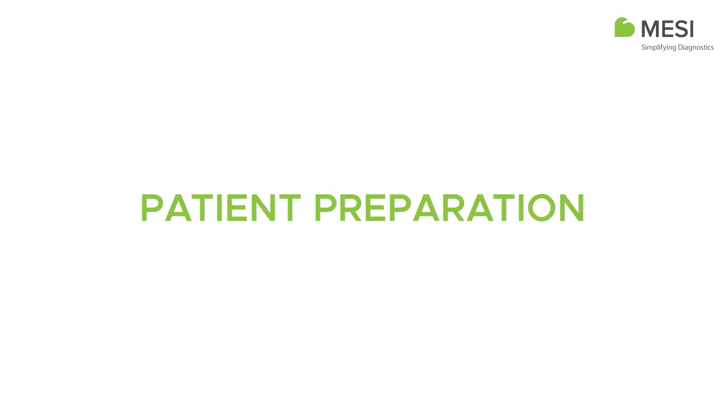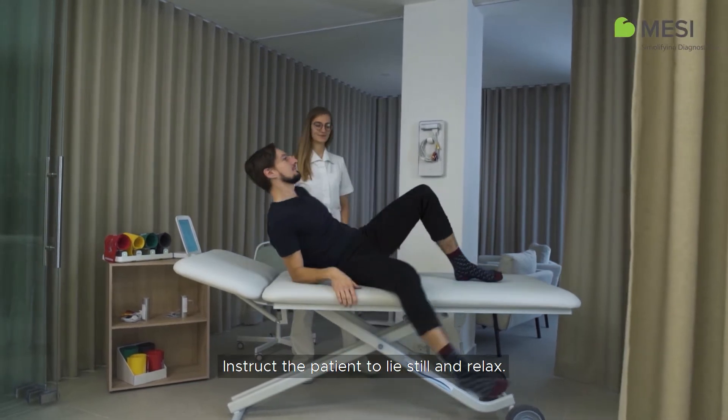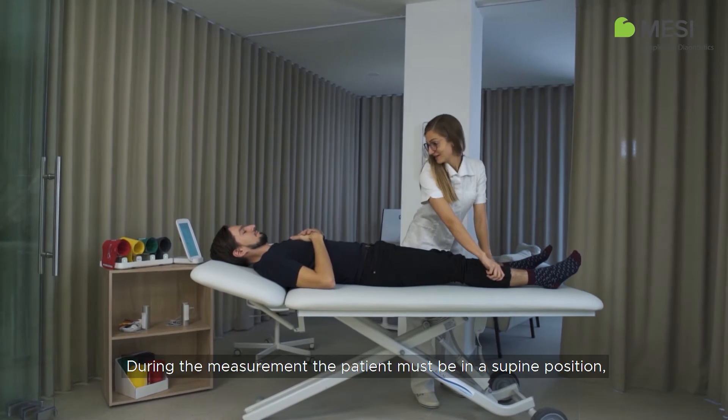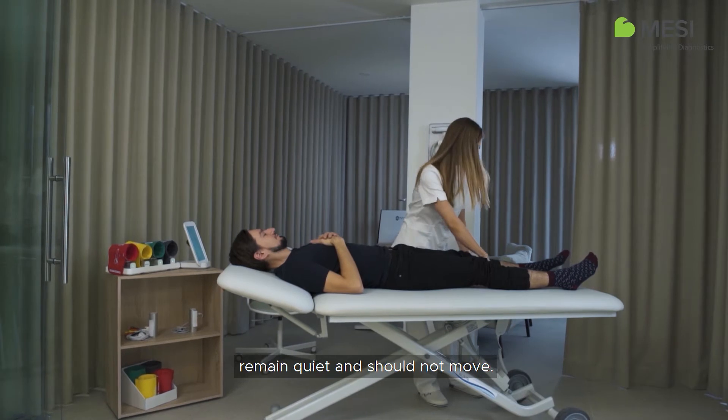Patient Preparation. Instruct the patient to lie still and relax. During the measurement, the patient must be in a supine position, remain quiet, and should not move.